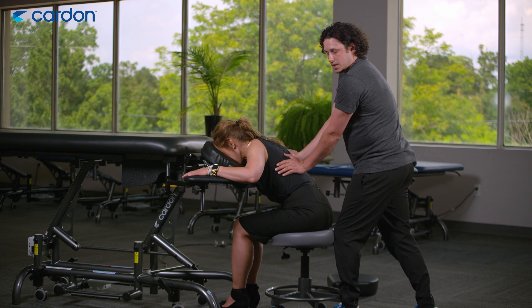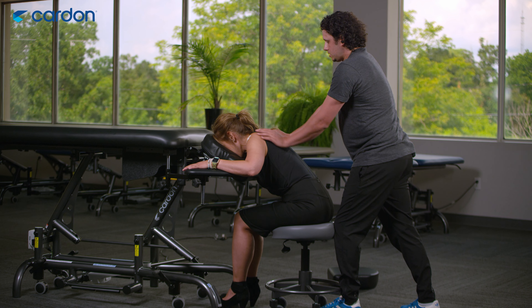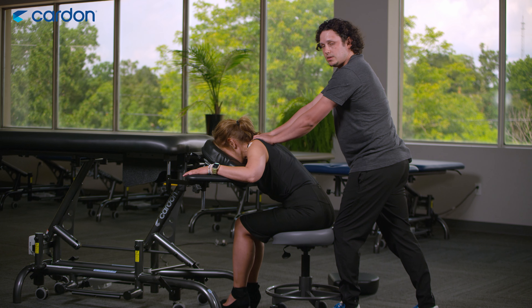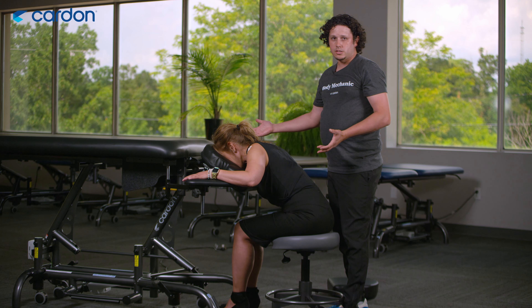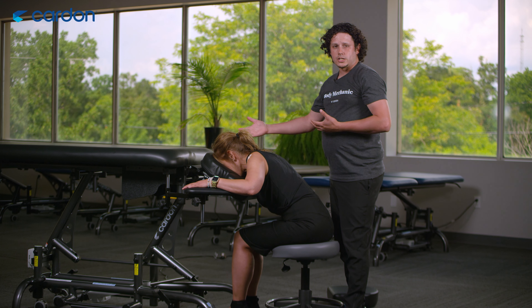It can actually benefit your patients quite a bit if they're worried about their clothing getting wrinkles on the table. You can still do your whole treatment session in this seated massage position — that's another benefit of the Cosmo and another way of actually treating in this position.